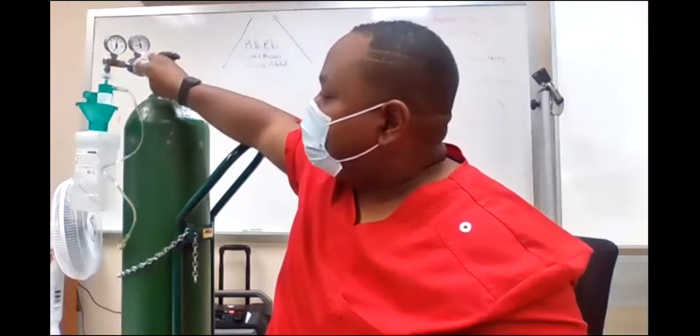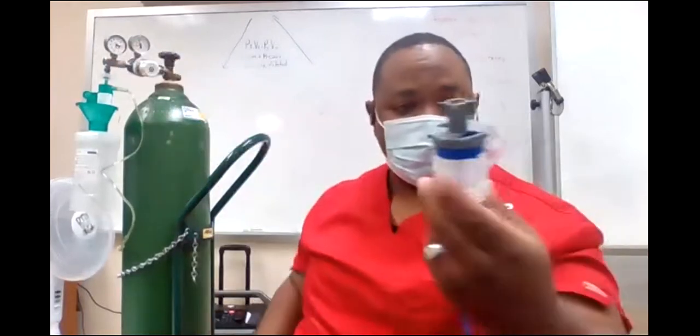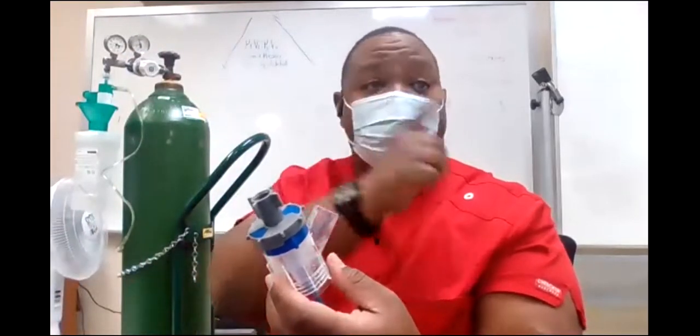Very rarely will you have to deal with that. Usually you're just going to have the ones you saw on the PowerPoint. These right here, okay? And like I said, they come in different colors and shapes and sizes, but as long as they have the Venturi principle on there, that's what you would use. Cut your flow up and you're there, okay? That's what they own, either aerosol, whatever you got them on, aerosol T-piece, aerosol trach collar, aerosol face tent, or what have you. That's all it is. Don't overthink it.